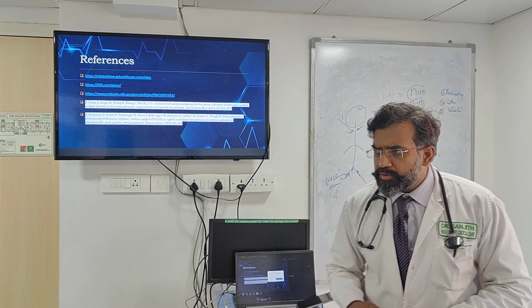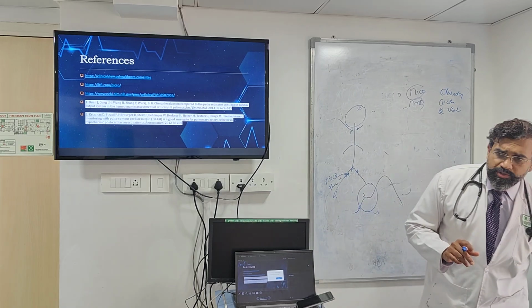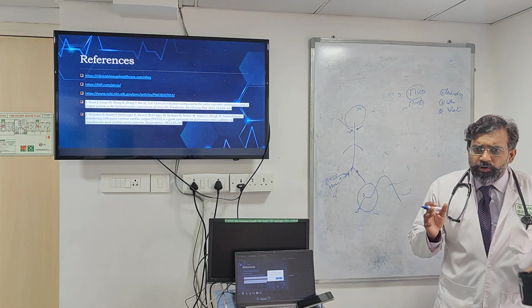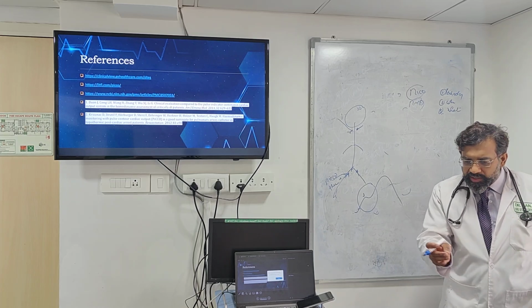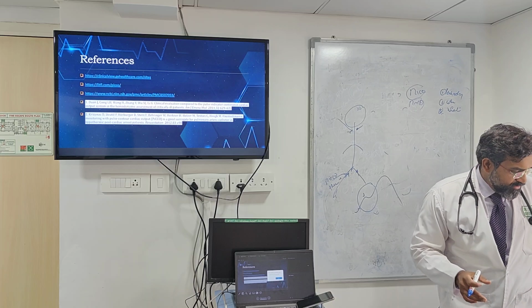How can you reduce the hump? For example, you have femoral artery and vein. How can you reduce the hump? Think logically, what should be done? If I want to reduce the hump, I want the temperature to rise slowly, or rise very little. Inject less? I'll remove the artery and keep it backwards. No, I'll not keep the artery line very close to the vein.